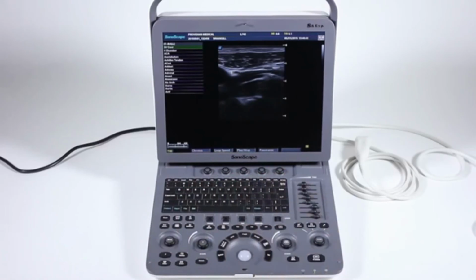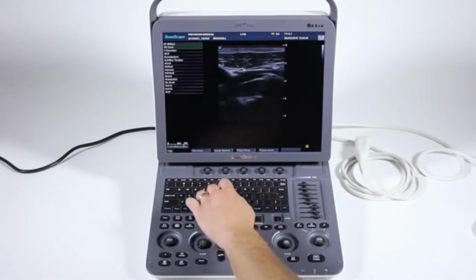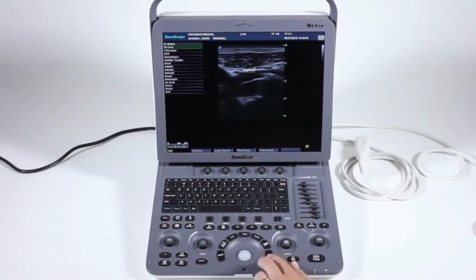If I just want to do a manual one, I just move the trackball around, go ahead and type it in. I'll click set to save it or move it, and then I can save that image or do whatever I want. To get out of annotations, I just hit ANNOT again. To clear that, go ahead and hit clear, and it'll clear that annotation.